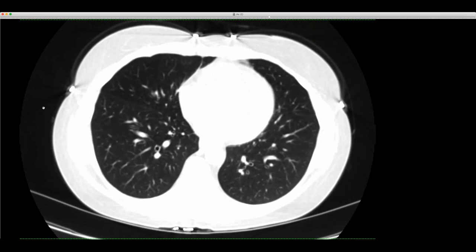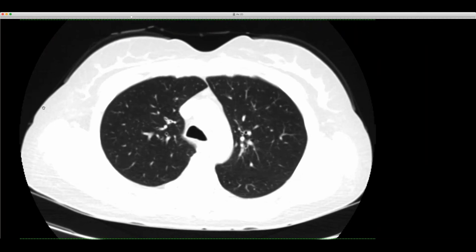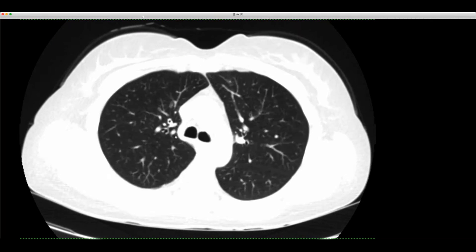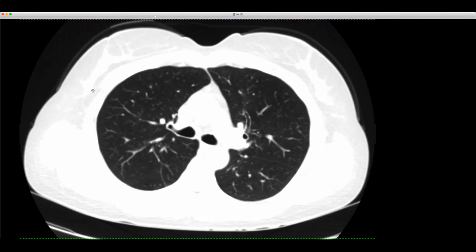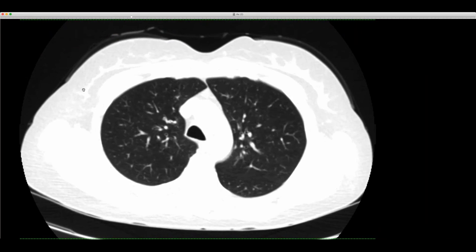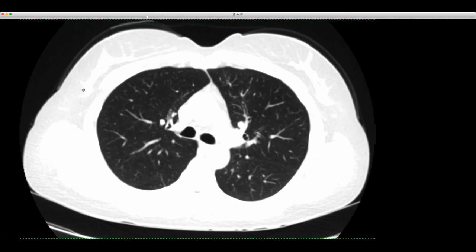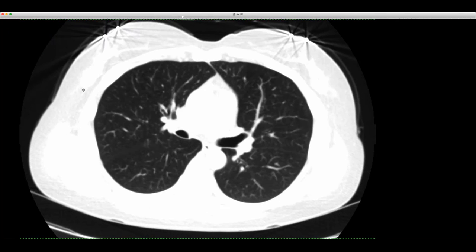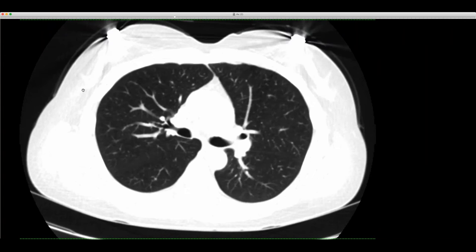Then I start delving into the other differential. Other people have seen these cases too — where you'll have a very early or mild ABPA that can start like this without much bronchiectasis. There's a spectrum of ABPA that can look like this. You can find cases of adult-onset cystic fibrosis that just present with bronchial thickening, and cases of eosinophilic bronchitis that look like this.